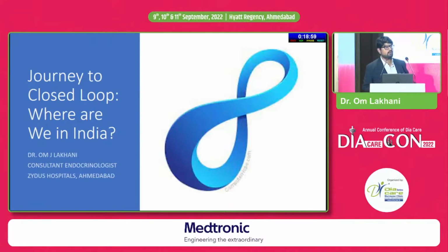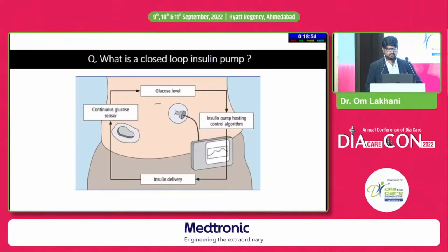So we are going to talk about the journey to closed loop insulin devices. Where are we in India? So what's a closed loop insulin pump?